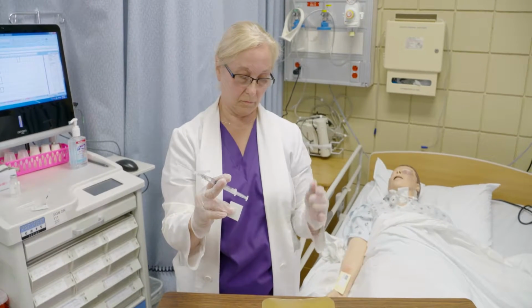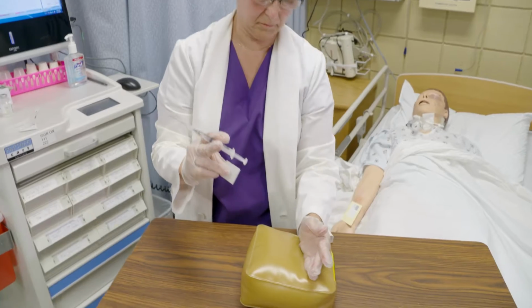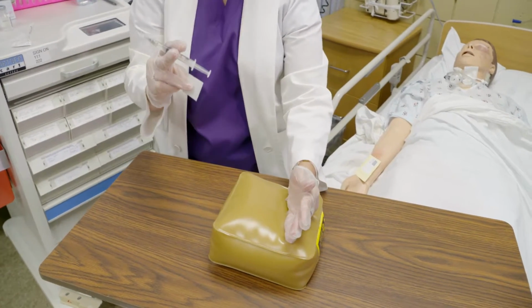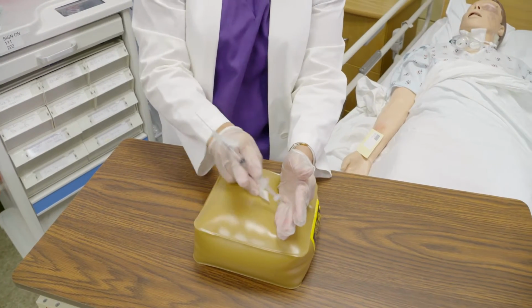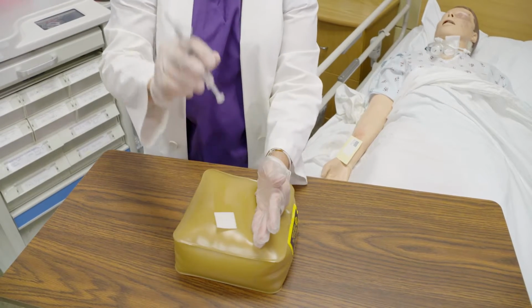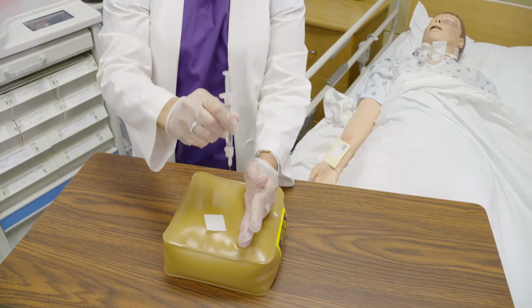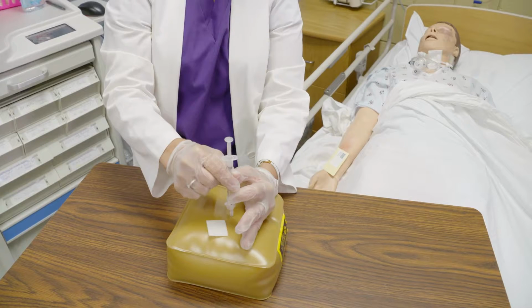Using your non-dominant hand, slide the muscle aside using the side of your hand and hold the muscle in place. This helps the medication to be injected deep into the muscle. Cleanse the site with alcohol pad in a circular motion. You can lay the alcohol swab near the site. Inject the needle using a 90-degree angle. This ensures the medication is deposited into the muscular layer.